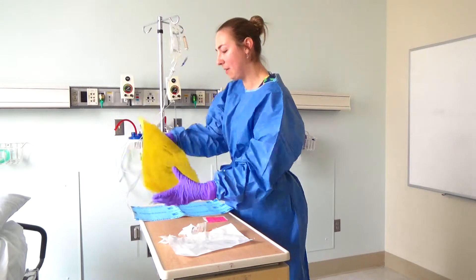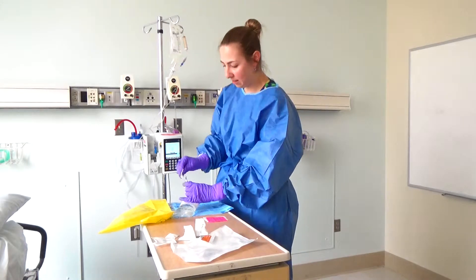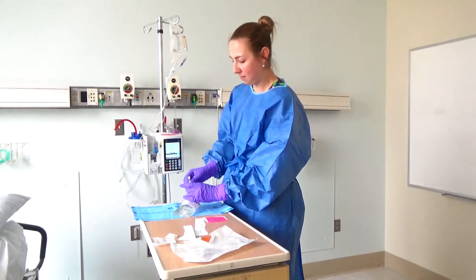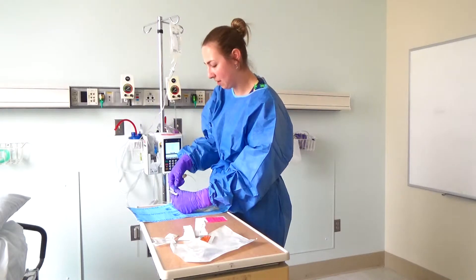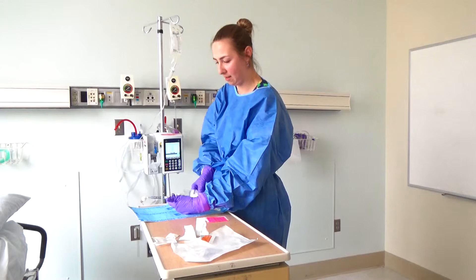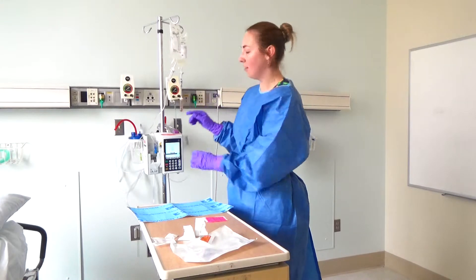Now I'm ready to attach my chemotherapy to my secondary line. I'll take my chemo out of my chemotherapy bag and lay it flat on my prep mat. I'll take another alcohol swab and clean the port on the end of the bag, keeping this at waist level. I'll lay the bag flat, cradling the connection piece. I'll take my secondary tubing, remove the cap I put on to keep it sterile, and twist that onto my chemotherapy bag. Then I can hang this, unclamp my line, and give my chamber a squeeze just to make sure the chemo comes down into the chamber.